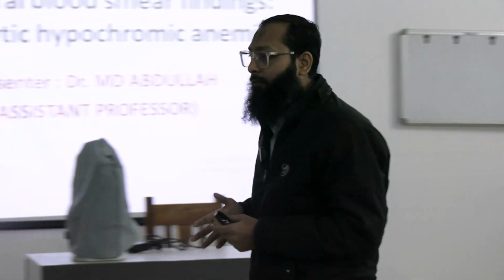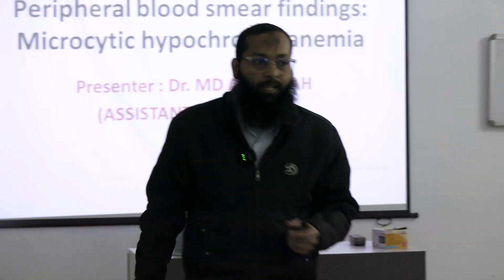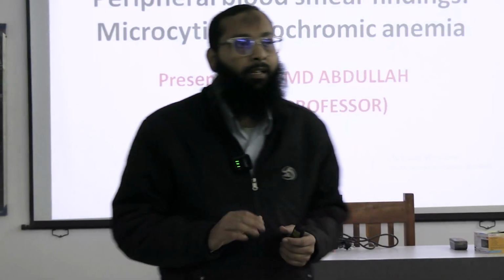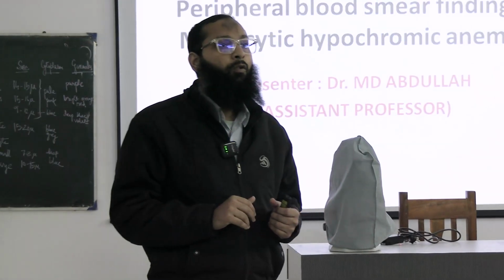Now after making the peripheral blood smear, what are you going to do? Please tell me. After you have prepared a peripheral blood smear. Very good, air dry. Then after that, what will you do?